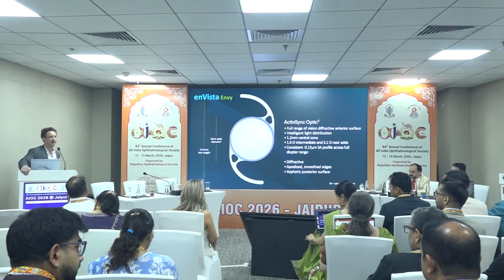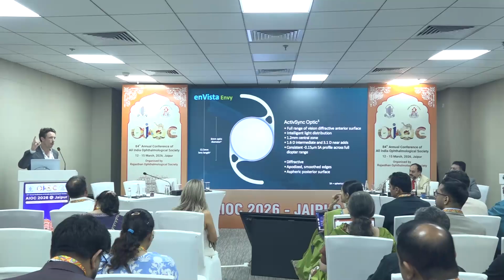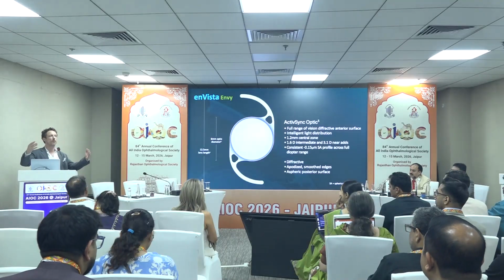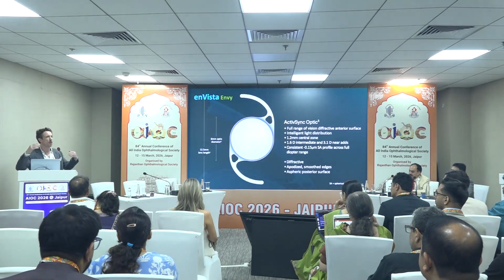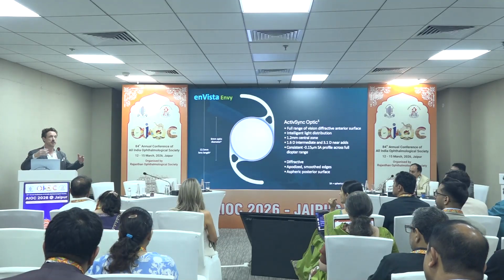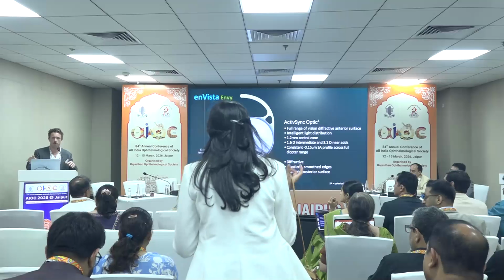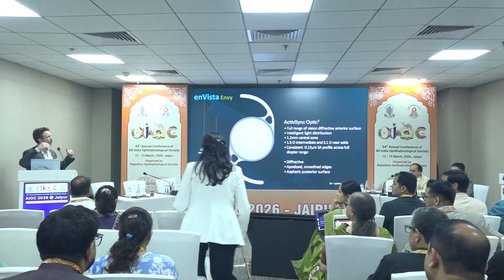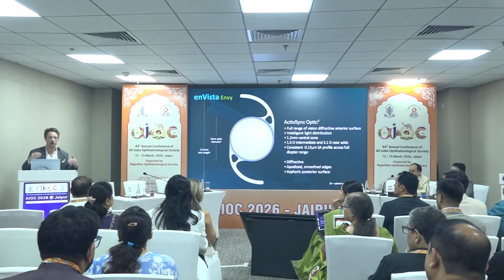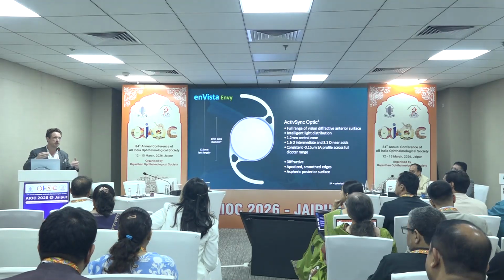We've been using it a lot, and those results that I showed where it was 93% of patients with little to no bothersomeness, that's at 1 month. So we used to think with the old full visual range lenses, you'd put it in and at 1 month the patient would be kind of unhappy with their glares and halos, but they had really good vision, they'd be happy with the range, and you'd be like, this is a really good early result. I think 4 or 5 months from now you're going to be happy. What the new lenses do is patients are happy early. A lot of them don't get the dysphotopsias at all, and if they do, they're very mild.